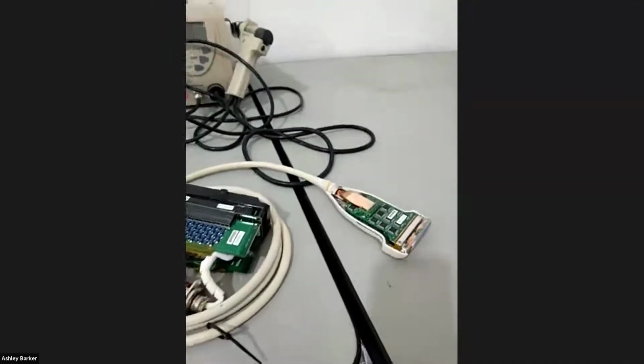Yeah, that's right. All right, so I'm just going to flip my camera around. Right, have you still got me? You can see that? Excellent. So this is a probe.